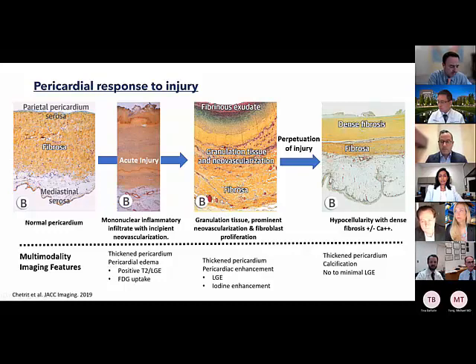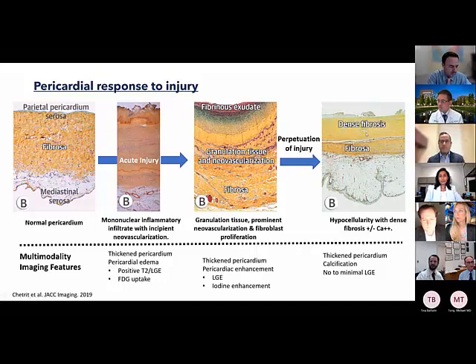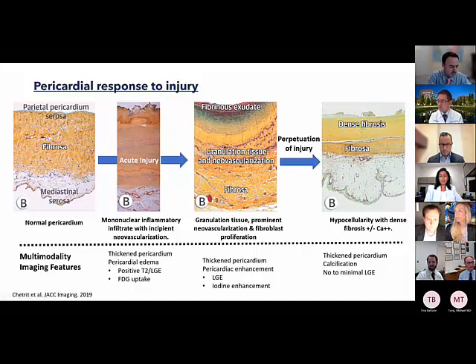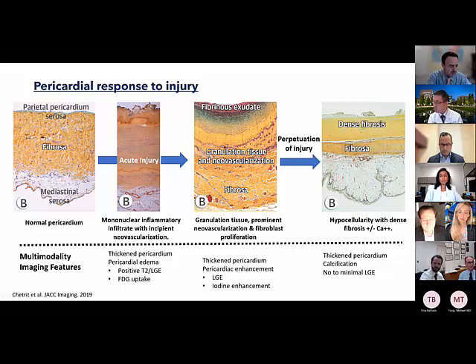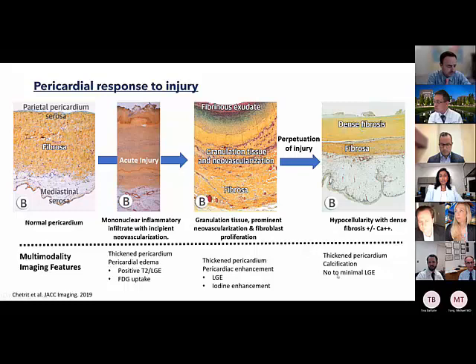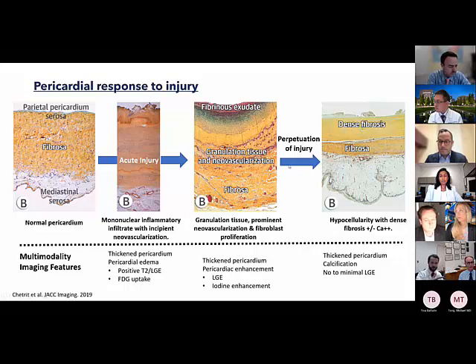As injury continues, the pericardium may heal with either fibrosis or calcification. In these cases, the pericardium remains thick with dense fibrosis and calcifications, most neovascularization disappears, and on imaging we see a thickened, calcified pericardium with none to minimal late gadolinium enhancement. This represents the spectrum and natural history of pericardial injury.